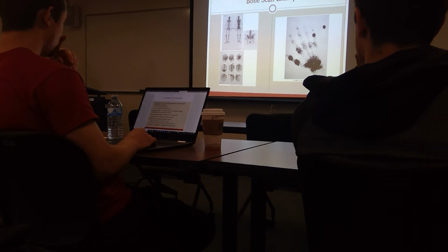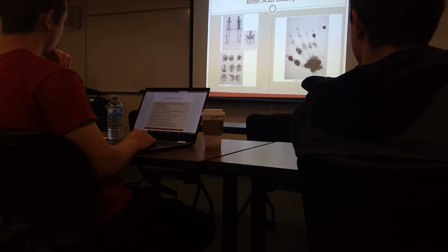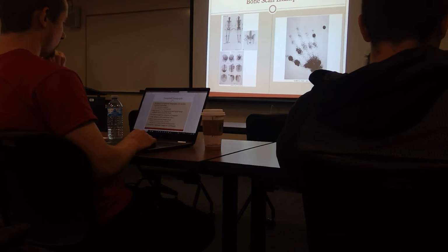Doesn't tell you what kind, but it just shows that there's increased uptake. Now, that would all need to be investigated, but when they do a biopsy or further testing, they found out that it was a metastatic original tumor. From the picture, you just know it's more of a metastasis because it's the full bone and not just a joint? My guess is they looked at all of these and probably did blood work on top of it, and there were markers. Metastases causes bone demineralization, among other things, and there were additional blood markers here. So you don't get it just by the bone scan alone.